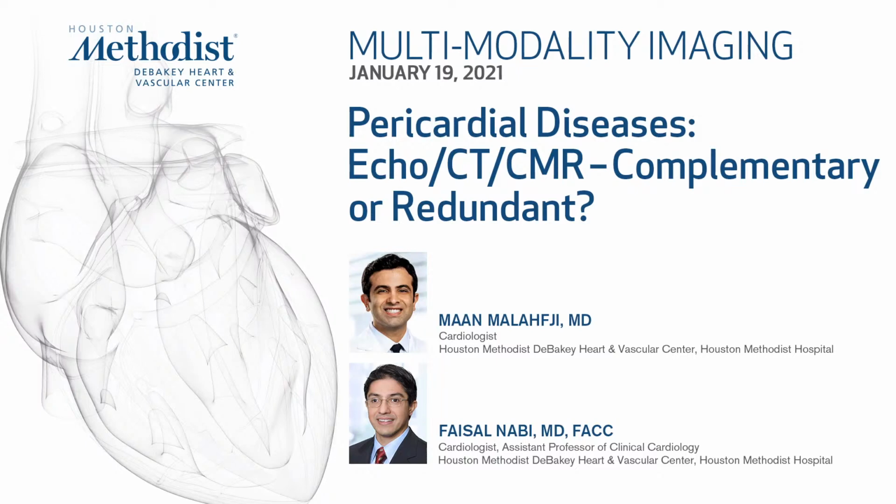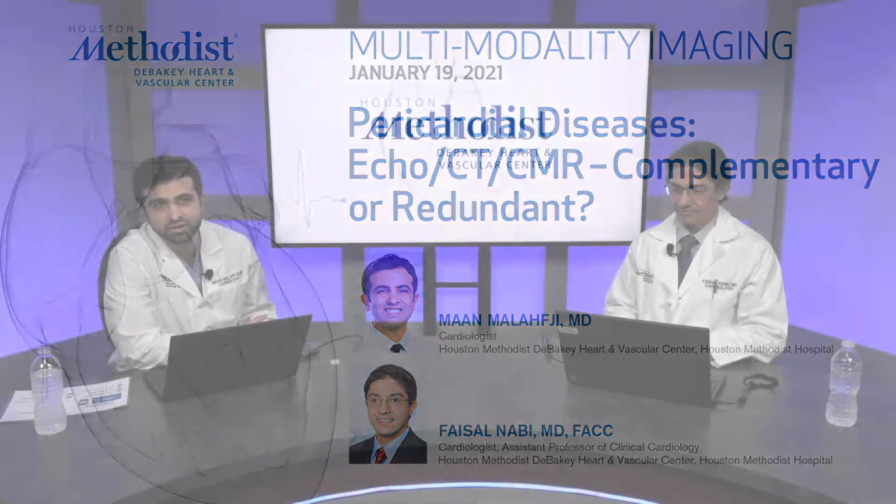I'm Maan Malahfji. I'm one of the new cardiologists here at the Methodist Hospital, and I'm going to discuss the echocardiographic diagnosis and evaluation of pericardial disease.